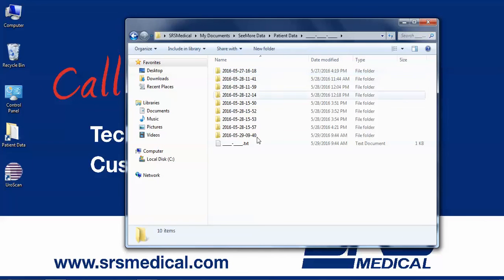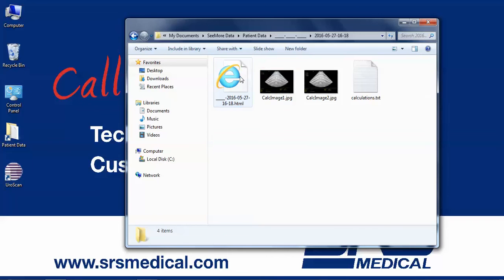So we'll go to this patient here with the underscores for names, and we can see that tests were done on these dates at these times, and if we look in there, we can see exactly the details of each test. So you have the calculations, the 2 images, and then a full report. So this includes both the images and the calculations. So you have the images separate and the calculations separate, and then a full report with all of them on one page that you can print out from here, as opposed to printing it from the software.